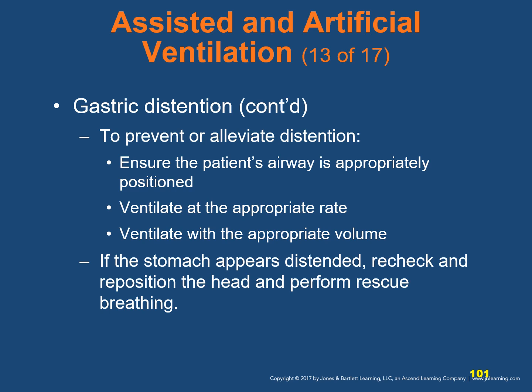As its compliance decreases, you will notice it becoming increasingly difficult to squeeze the BVM to get air into the lungs. Slight gastric distension is not of concern. Severe inflation of the stomach, however, is dangerous. It may cause vomiting and increase aspiration risk during CPR, and can significantly reduce lung volume by elevating the diaphragm, especially in infants and children.